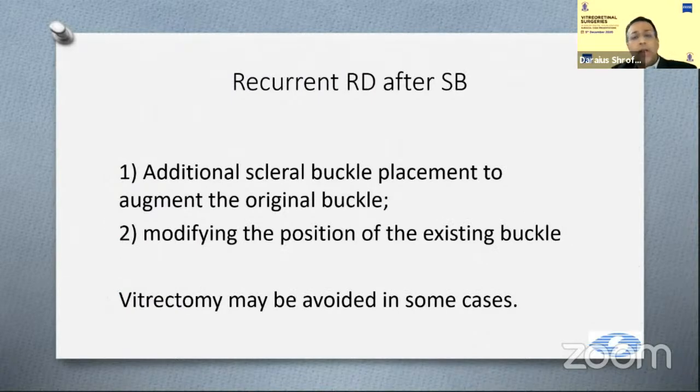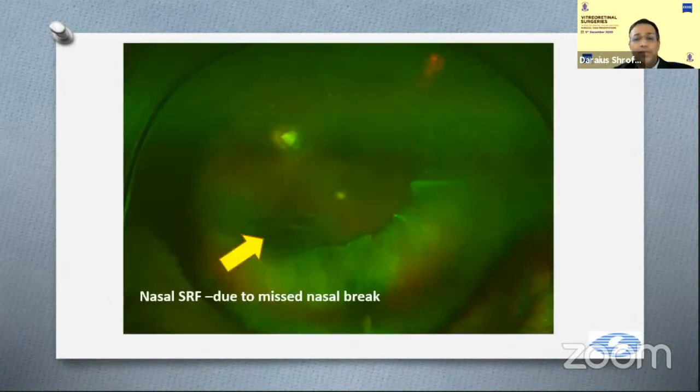So recurrent RD after buckle, with the addition of a buckle element. I think Aditya said buckle has become very rare, but I think we are still a little old fashioned. We still do it quite often. And this was a phakic patient, 47 years old.